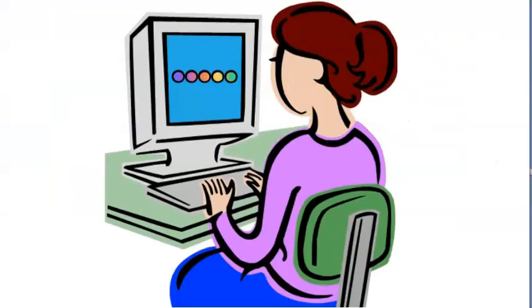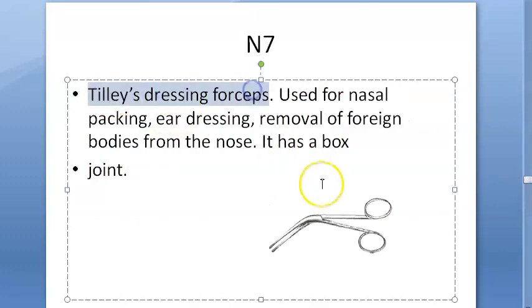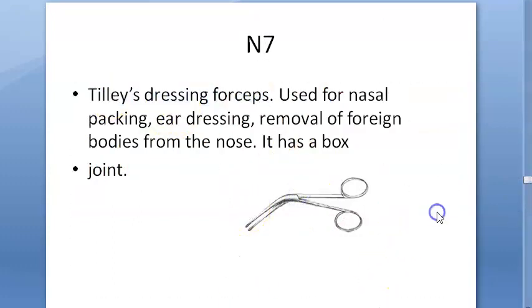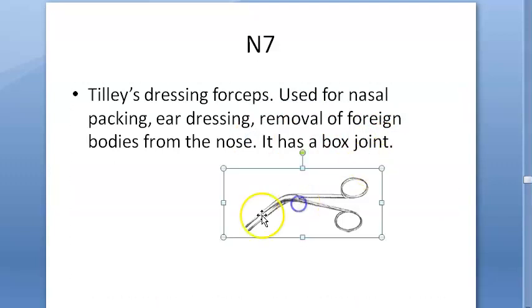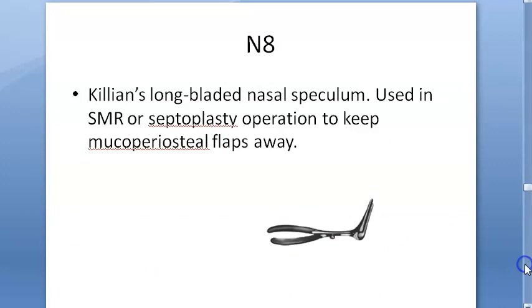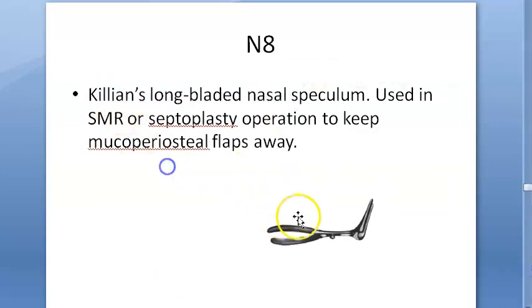Next, Tilly's dressing forceps — very common. It is used for nasal packing, ear dressing, and to remove foreign bodies from the nose. It has a box joint. This is very common and you should know it — Tilly's dressing forceps.